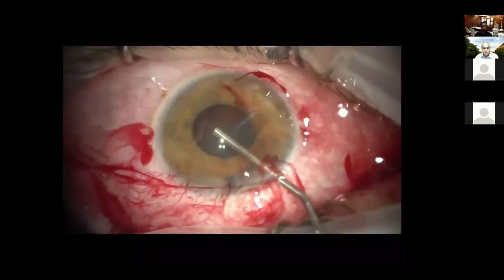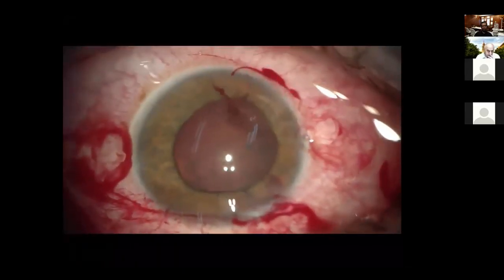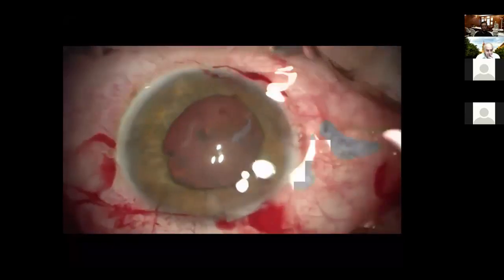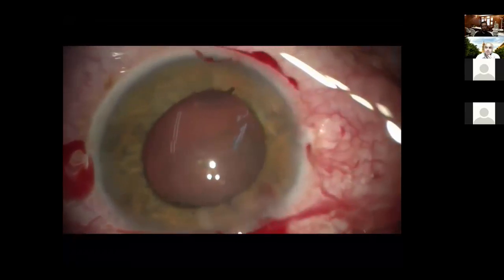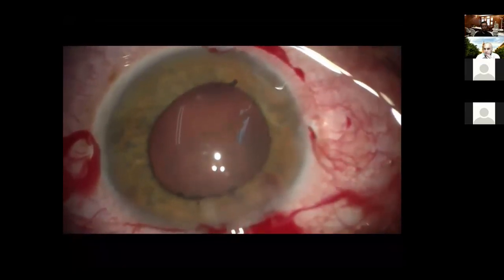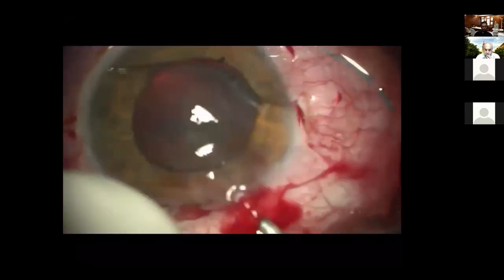You might encounter some miosis in such cases because of the trauma that resulted from manipulating the phakic IOL. But you can always use adrenaline through your drip, or you can use viscoelastic to redilate your pupil once again and rely on the fluidics and the pressure of the fluid entering the eye in order to maintain this dilated pupil.